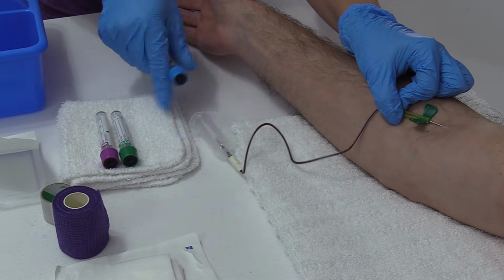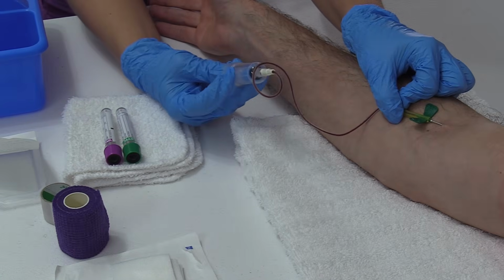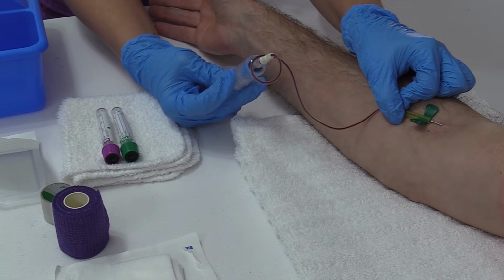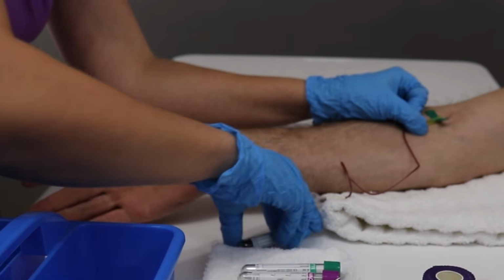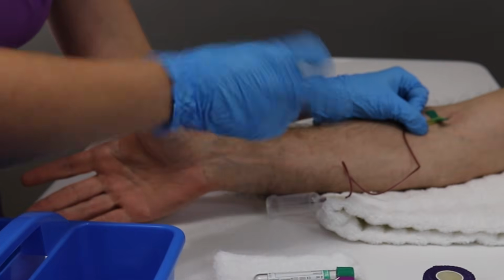Now I'm going to do the blue. Let that fill all the way to the fill line, because remember that was an important tube. And it's filled exactly where it needs to go. Now I'm going to invert it about 3 to 4 times. 1, 2, 3, 4. Set that in my basket.